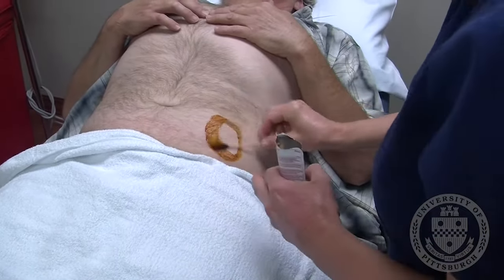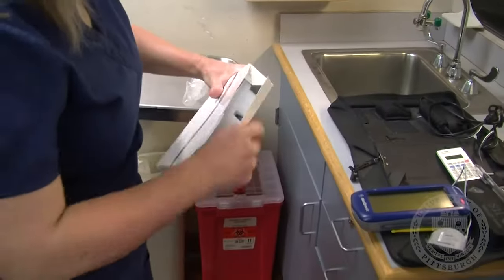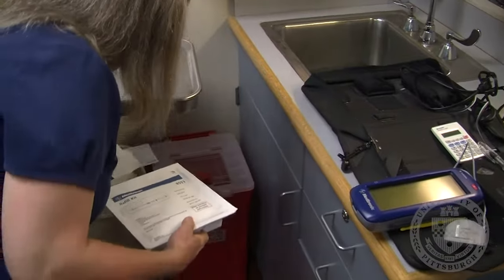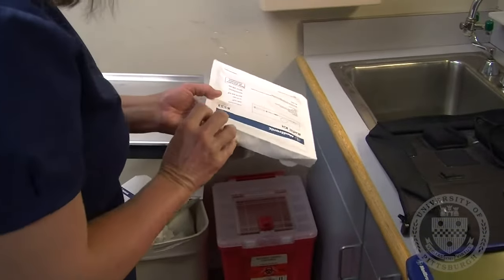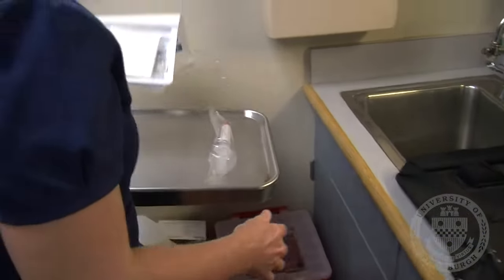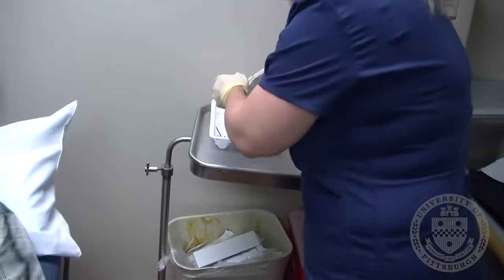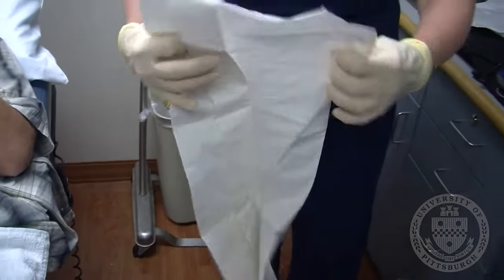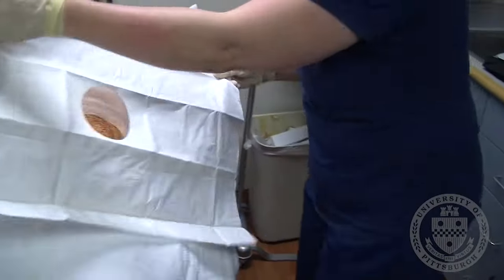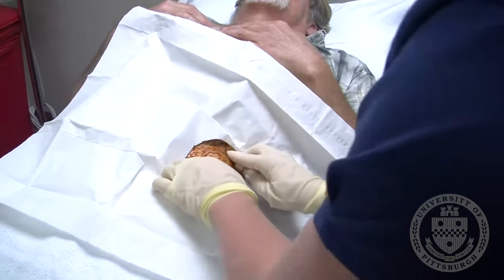The skin surface is cleansed with Betadyne, or another cleansing agent if allergic. The sterile refill kit is opened. Sterile gloves are donned. A drape is applied to create a sterile field. Please be careful not to touch your abdomen from this point forward.